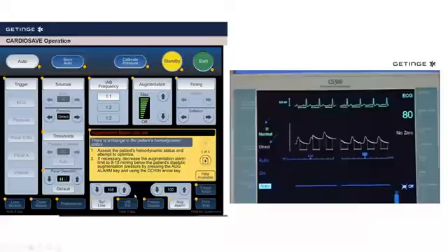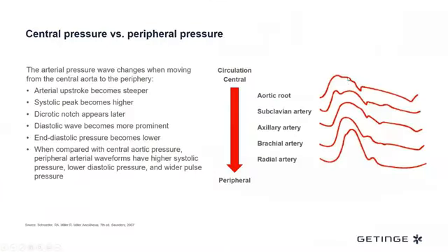That's not ideal because radial pressure is different than aortic pressure, so you're not getting real-time adjustments of the aortic augmentation and the assistance, because with the peripheral pressure, you get higher systolic pressure, systolic amplification, and lower and more delayed dicrotic notch and diastolic pressure.